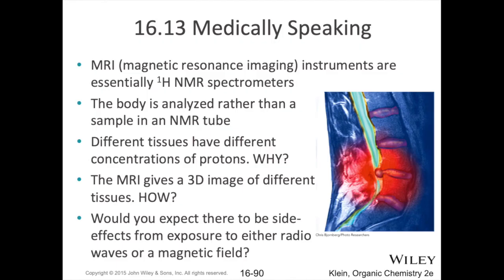You're putting your sample, in this case the body of the patient you're examining, in the presence of a powerful magnet, and just making a note of how the atoms of your sample are reacting to that magnetic field when radio pulses are in there, right? And instead of getting a graph from the FID data, you wind up with a picture of these different environments.